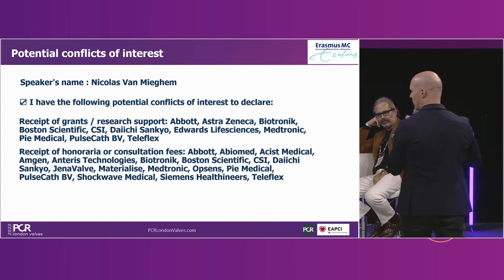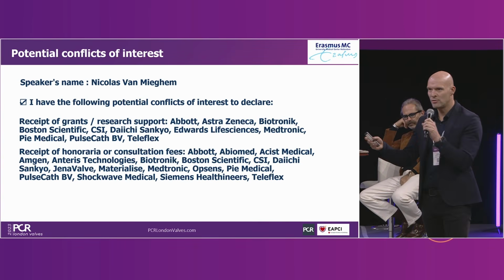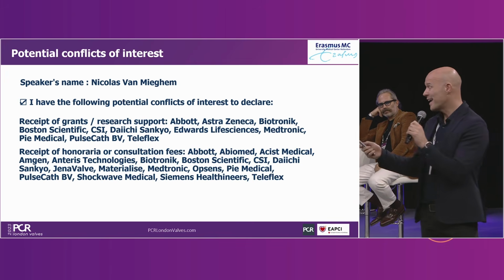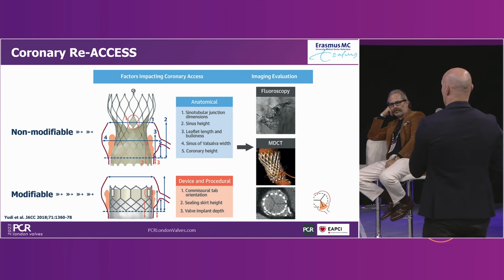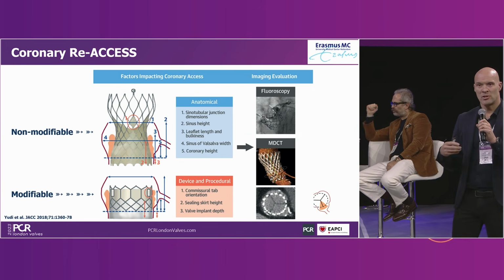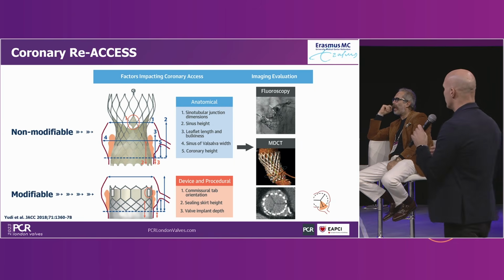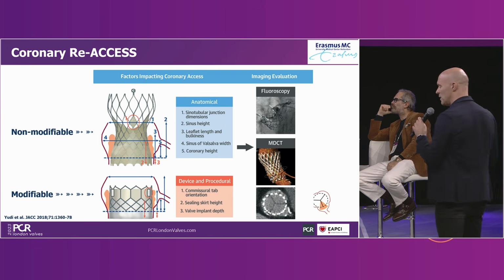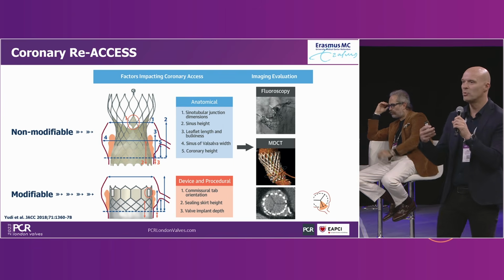Yeah, thank you, Ole. So a very important question and a very important principle that we need to consider as we are thinking about lifetime management, right? We are treating younger and younger patients with coronary artery disease, so you will have a significant number of patients where you will need to re-access the coronaries. I think this slide basically summarizes that there is a non-modifiable reality and a modifiable reality. Non-modifiable, obviously, we need to consider the anatomical reality.